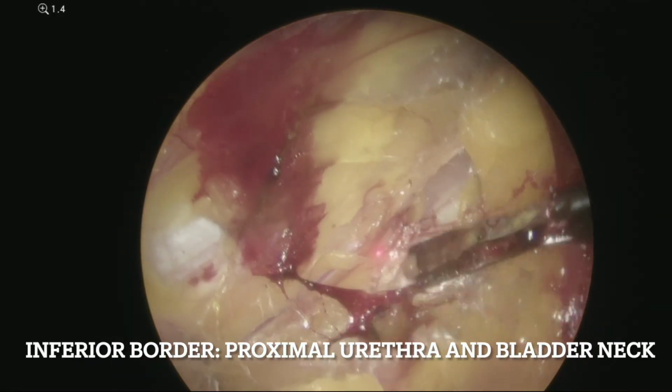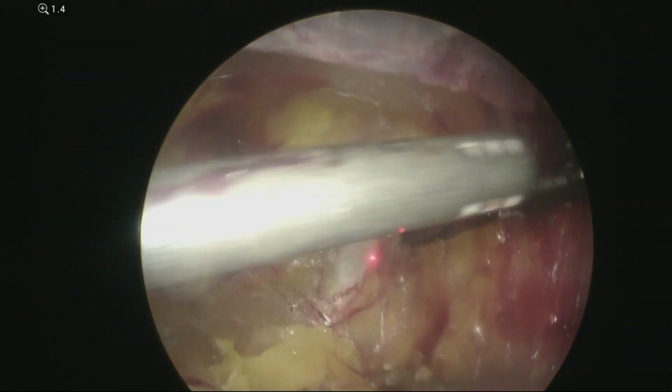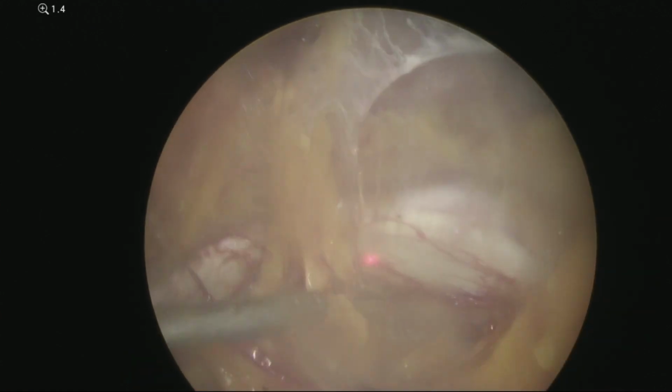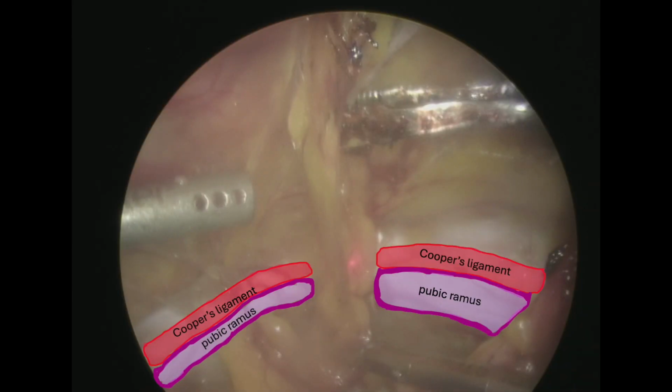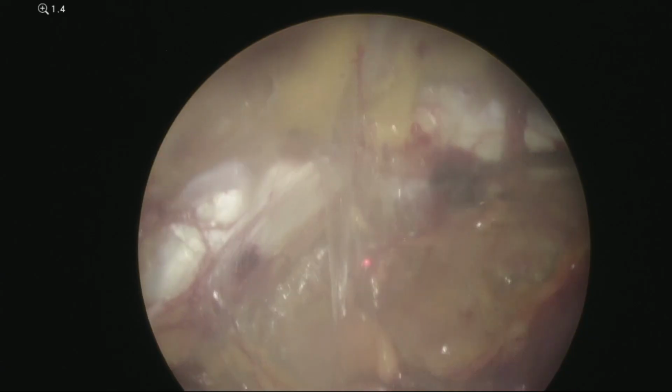The preperitoneal adipose tissue was dissected while the bladder was insufflated with CO2 in order to localize the dome. The dissection was carried down to the level of the pubic rami, and the iliopectineal ligaments were exposed bilaterally. The mass was then identified within this space anterior to the bladder dome.